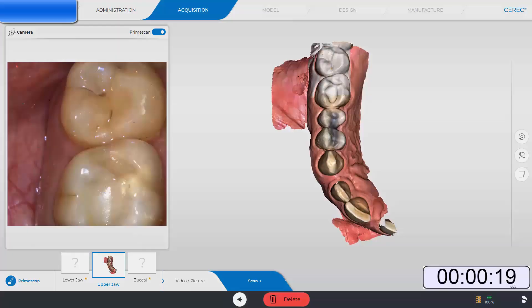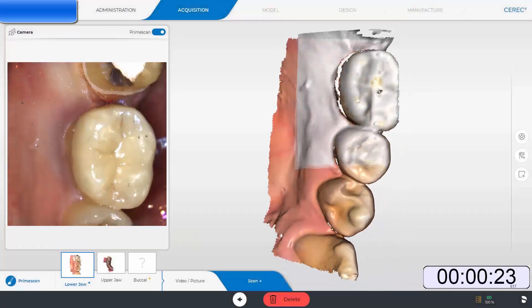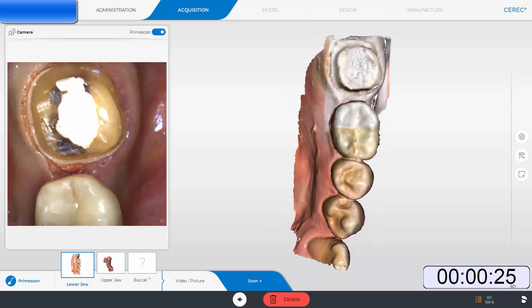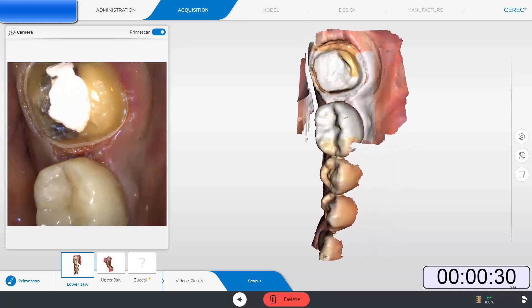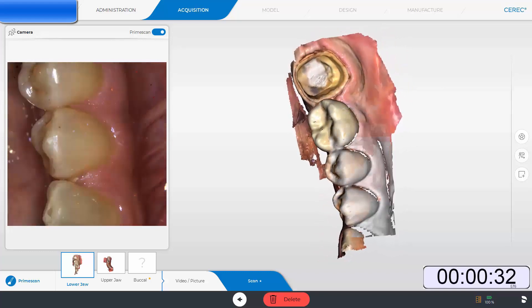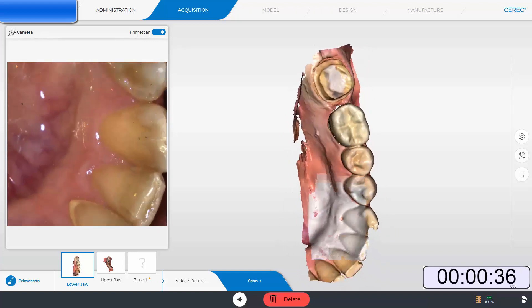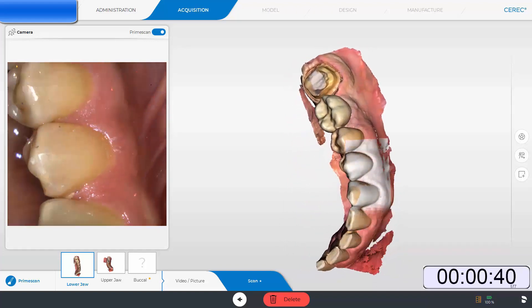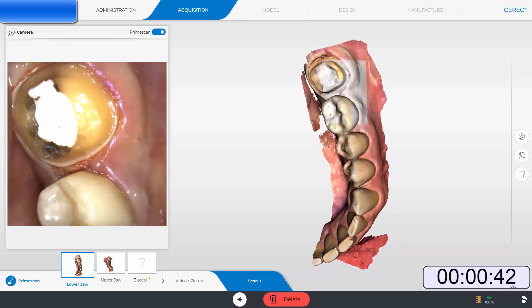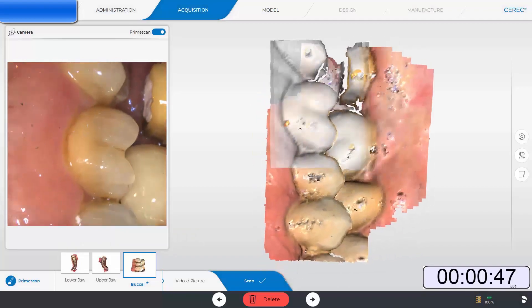Here you can see I am scanning the opposing dentition. Next, I am going to go to the preparation arch and scan tooth number 18. Notice how it fills in the proximal contact very easily with no effort whatsoever, even in that most difficult spot. After scanning the preparation arch, we will go to the buccal bite and quickly scan the buccal bite.